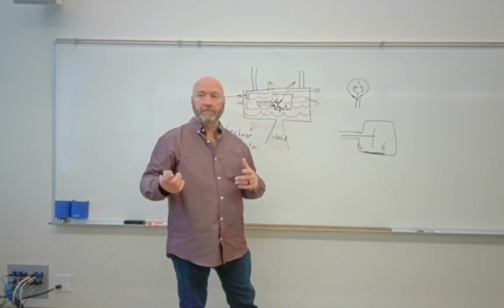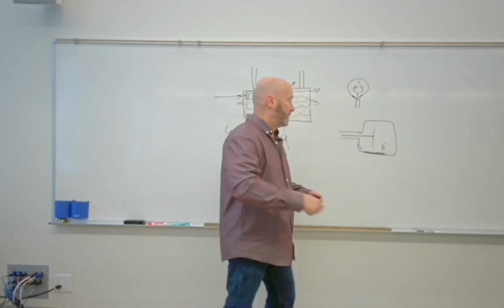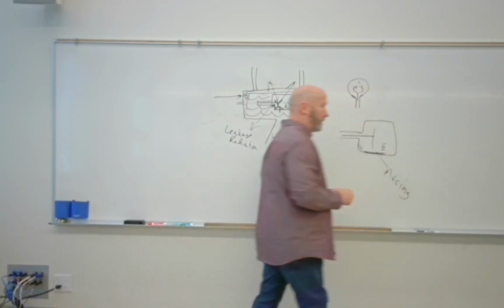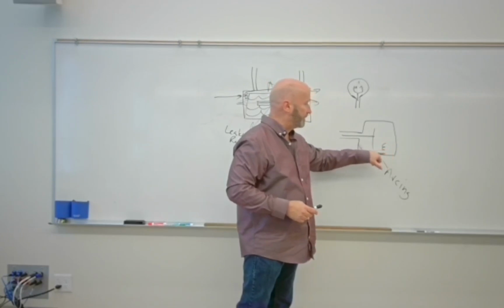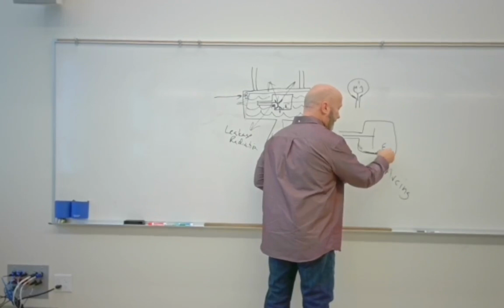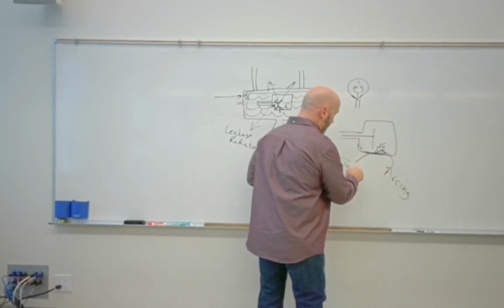Electricity, like water, follows the path of least resistance. So if it takes less effort for the electrons to go from here to here than here to here, then what you get is what we call arcing. And arcing occurs because with tube life, we're going to melt the filament. It's going to coat the inside of the X-ray tube. Miniature lightning bolts, right? That's your arcing. This is what we refer to as tanning.